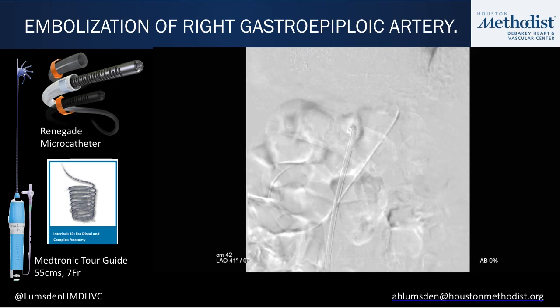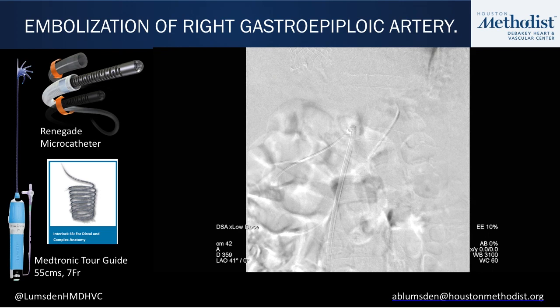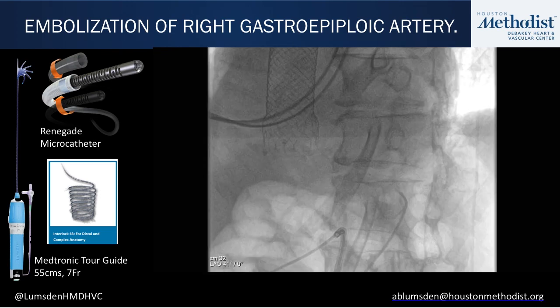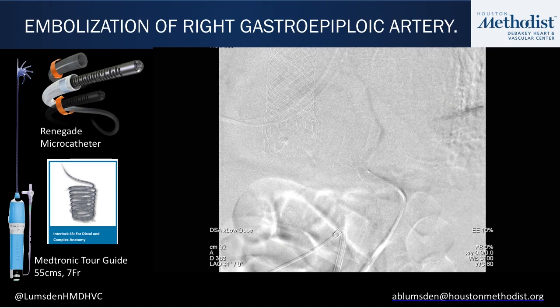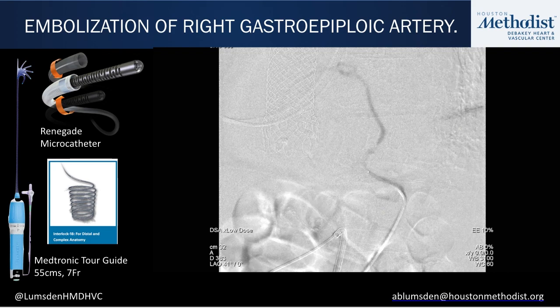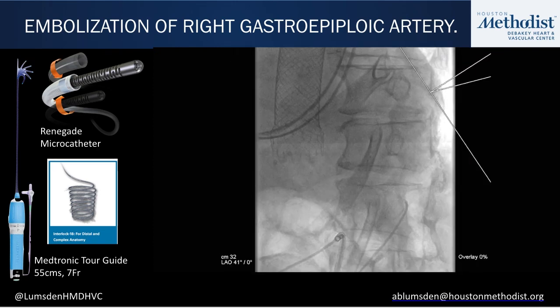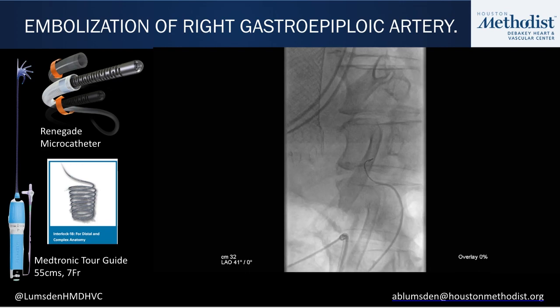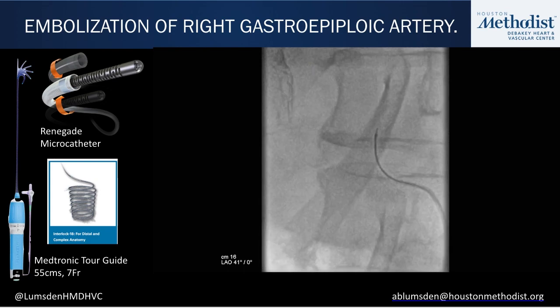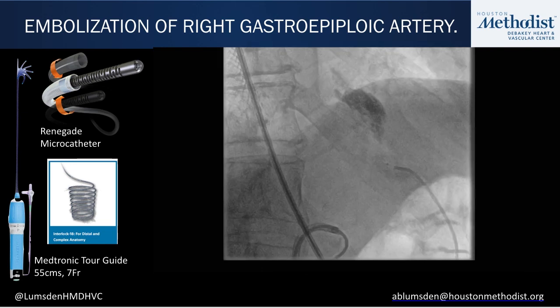With the wire removed we injected through the microcatheter — we were going in the right direction. We kept advancing the wire and following it. The microcatheter was now at least up in the chest — we were getting close. There was a little irregularity noted, which would come back into play. We had trouble crossing that irregularity; it was unclear whether this was something that occurred at the time of surgery or something caused by the wire. We had significant trouble getting beyond that point, and ultimately caused a small extravasation.